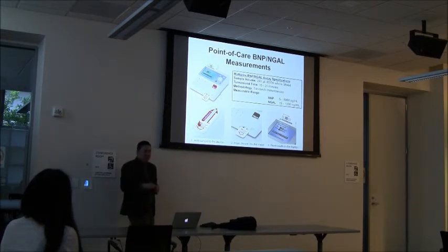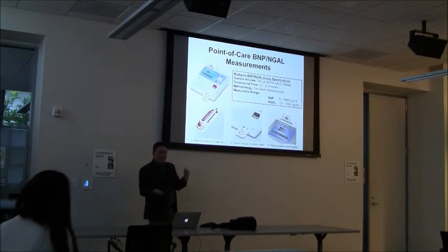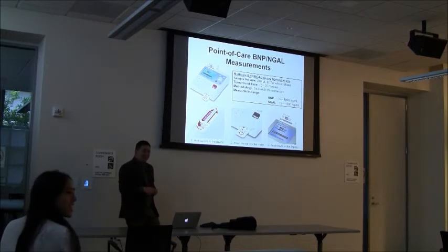The other problem that we ran into was consistency. Sometimes the rooms might be darker, might be lighter. We also ran into a problem with the commercial software. It wasn't that great, so we have to find better software for that. But if you know of anything, we'd love to check it out.